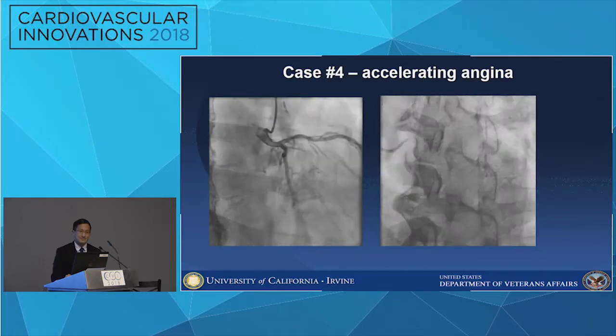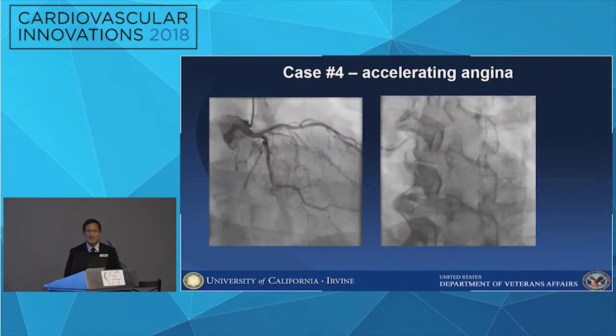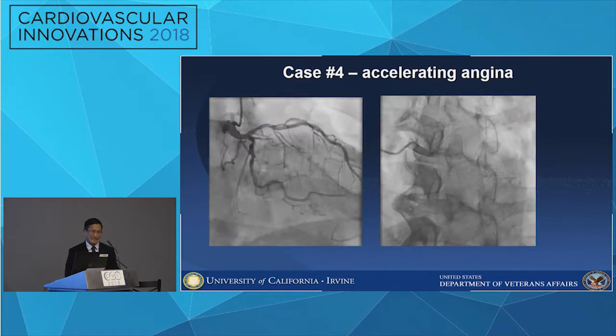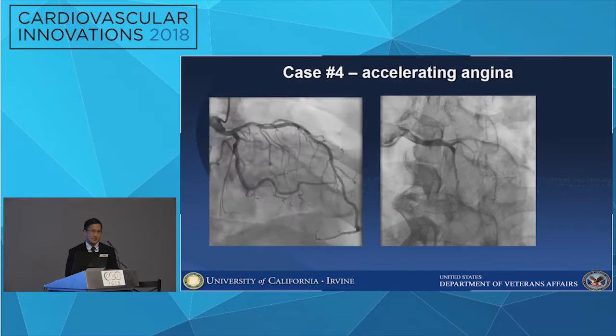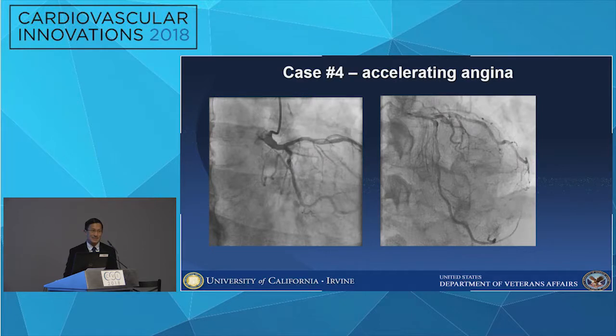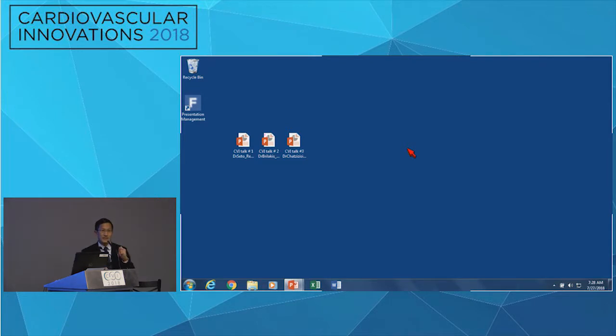Why can't you use a diagnostic catheter, since the wire's so small? Yeah, good question. If you think it's going to be negative, should you use a diagnostic catheter? I have done that. I've even done it without heparin, heaven forbid. But that's only when I really thought it was going to be negative. Now, of course, there's always a risk of damage to the vessel by wiring, and so if you go in with the diagnostic catheter only, you might be getting yourself in trouble. Hemodynamically, it shouldn't make a difference. It's a smaller bore catheter, so you might have more damping. But if you flush it correctly, then yes, theoretically, you could use a diagnostic catheter.